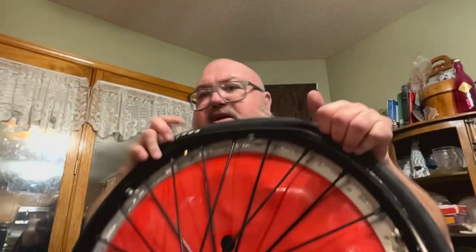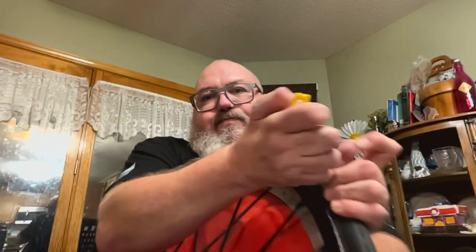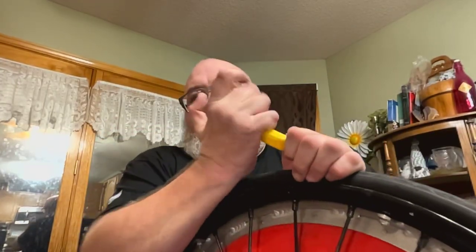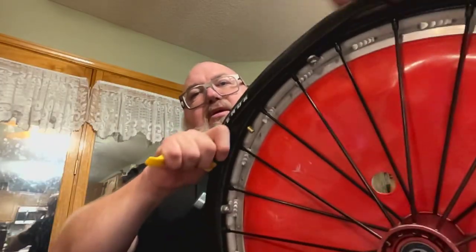If it doesn't snap into place, which it does not feel like this tire is old enough to do, because I just replaced it like a month ago, I grab my trusty little plastic tool, the Pedro tire lever. So I take it this side out, push it in. I take that, push it, put a little bit of pressure. Grab it down, and then I kind of start working that in. So it takes a while.